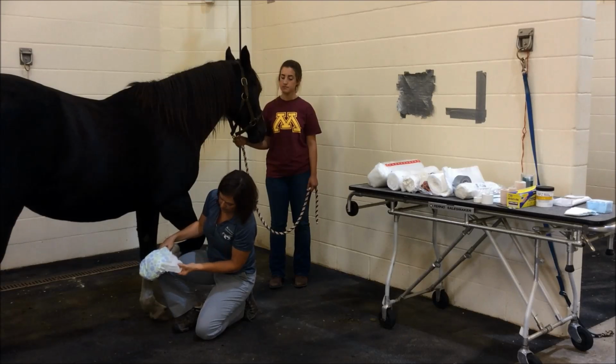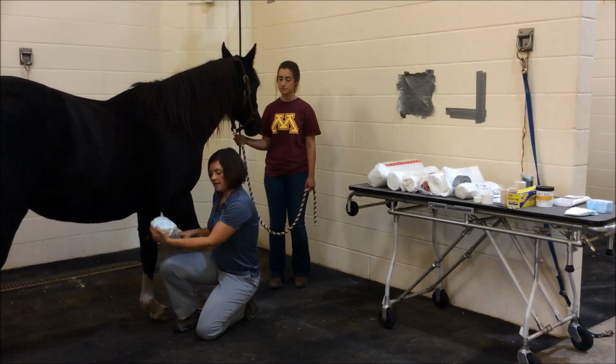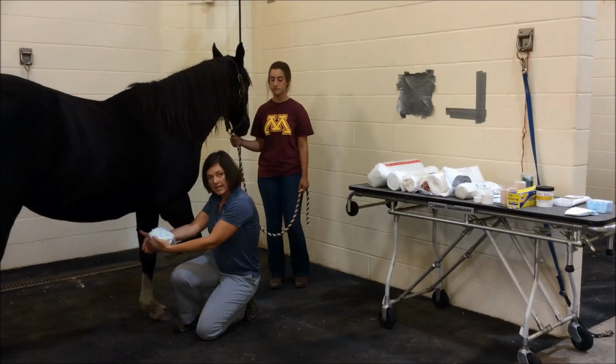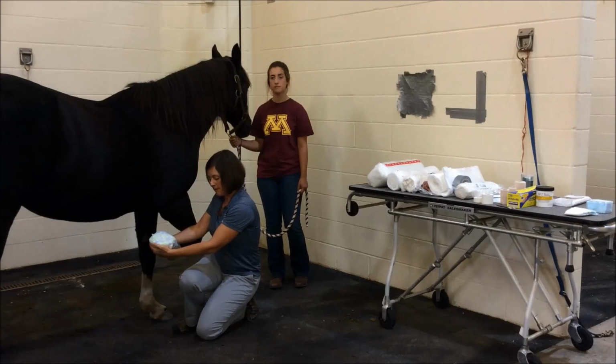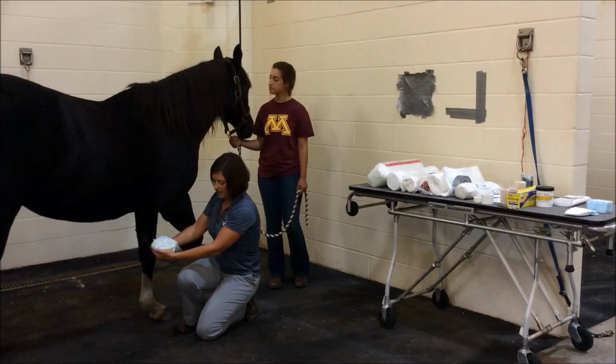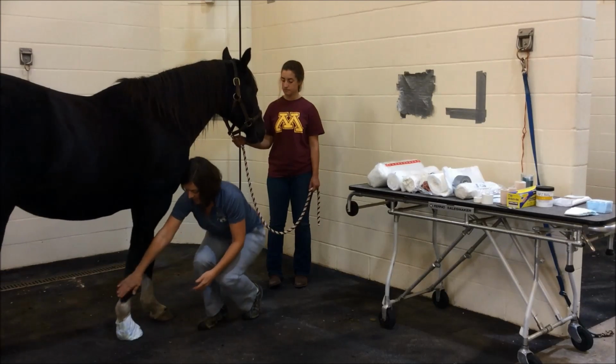One thing to remember when you're applying a foot bandage is that when you have the foot flexed like this, you can get the material too tight against the front or dorsal aspect of the coronary band. So we always want to be, again, aware that we're not applying anything too tightly to the foot. So she can rest that.